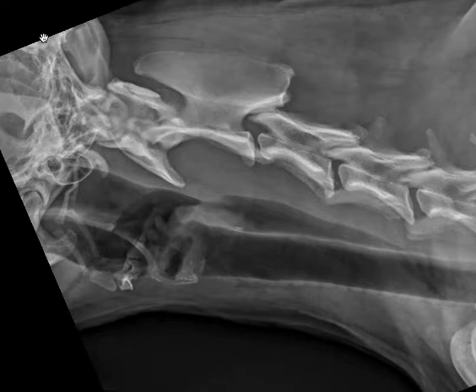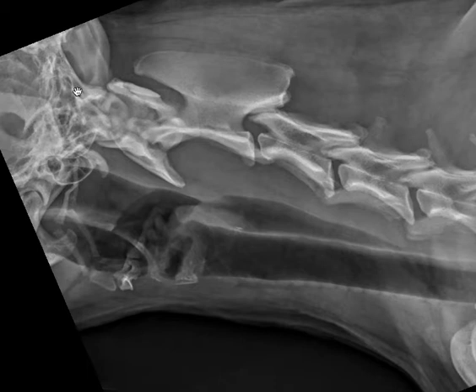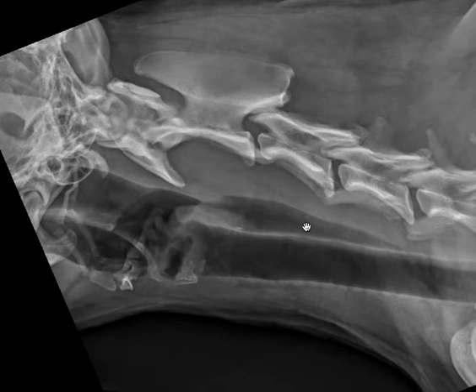Let's start with the big picture, and then what I'd like to do today is zoom in and go over the specific anatomic details in this region. The big picture would be that this is the caudal aspect of the skull. We have the first and second cervical vertebrae, the rest of the cervical vertebral column. Here we can see the esophagus - it's not always visible, but in this case there's a little bit of gas - and of course the trachea. Just at the cranial margin of the trachea is where we have the laryngeal region, and that's the part I'd like to focus on for today's session.